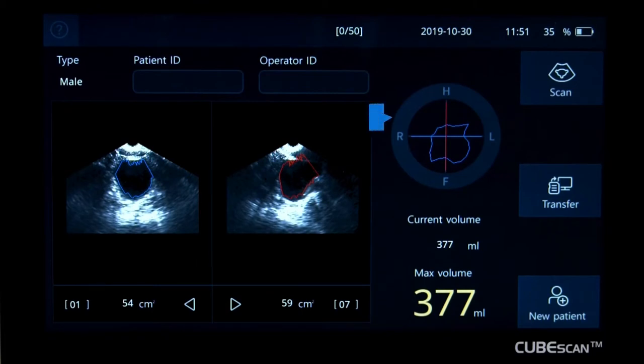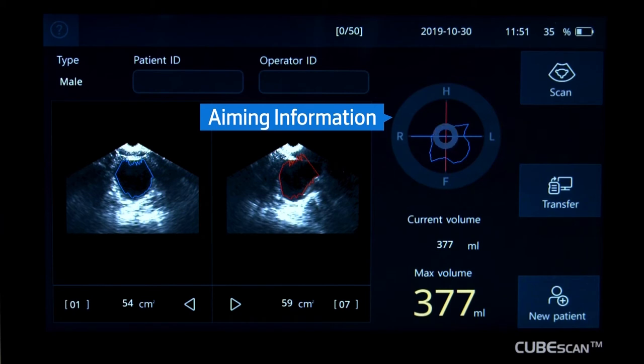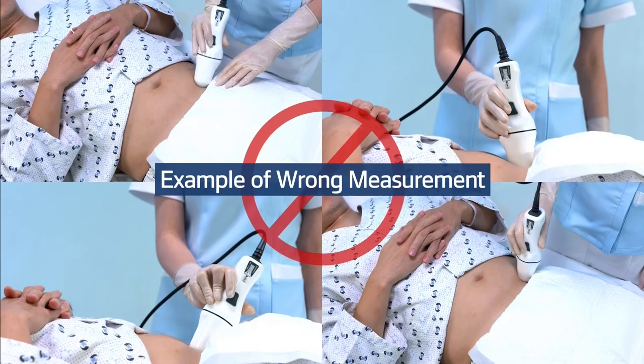After the scan, the measurement can be evaluated by the aiming information. The closer the bladder image is to the center, the better the result. The following are examples of wrong measurement — the result cannot be guaranteed in these cases.